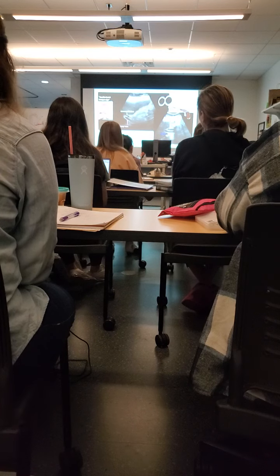It was quite cute. So, we do have something called the double barrel shotgun sign. As you can see, a double barrel gun, I didn't understand this, so I put a double barrel gun so you guys can see what it looks like. Two big barrels, right? The main portal vein and the common bile duct should never be the same size.